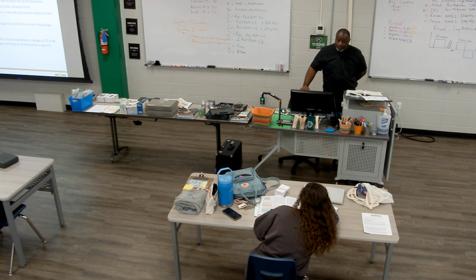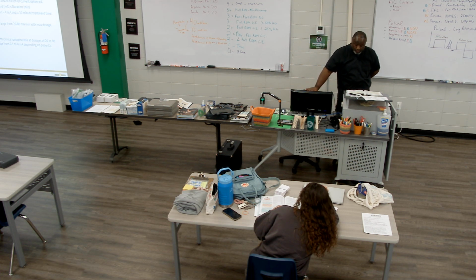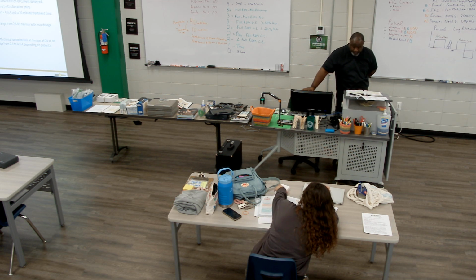So iontophoresis is done in dosages. Just understand that.